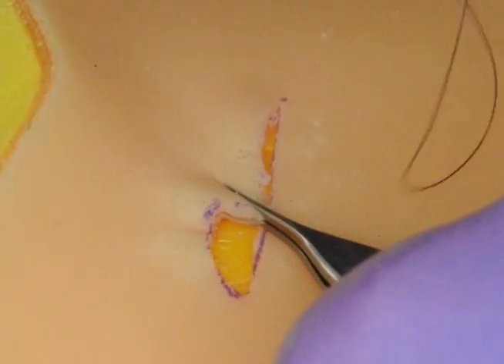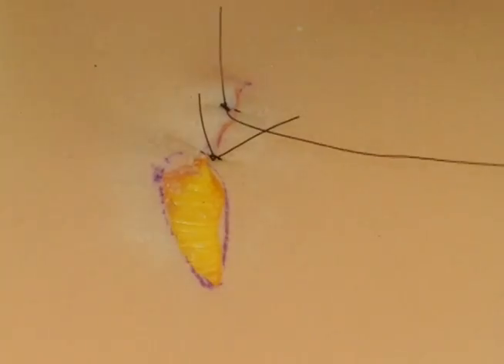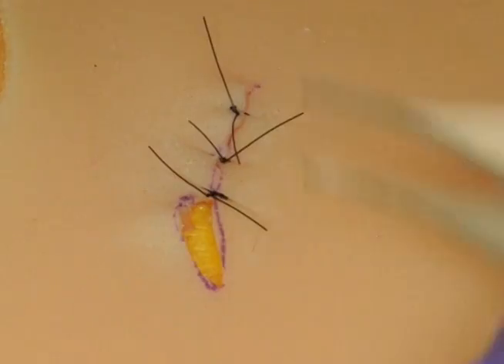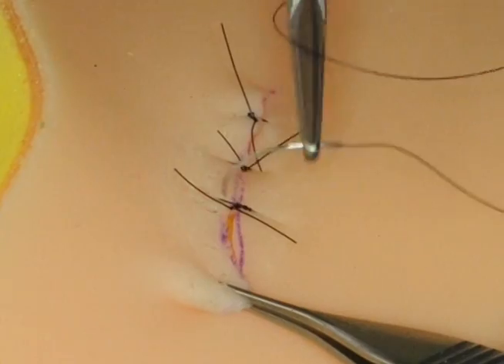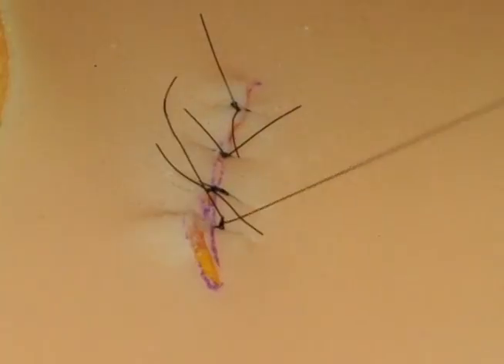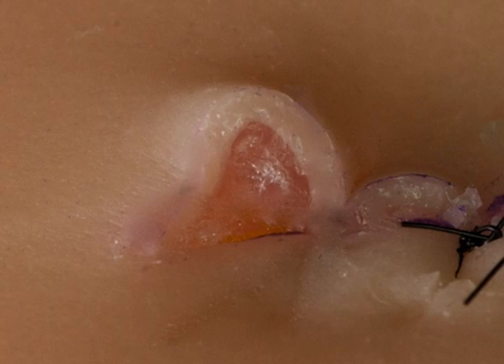Following this, we started at one end of the skin model and stretched it on the curved side of the wound while suturing down through the subcutaneous tissue into the adjacent wound edge. With sufficient stretching, which is really quite a lot, you will produce a dog ear defect for practice.